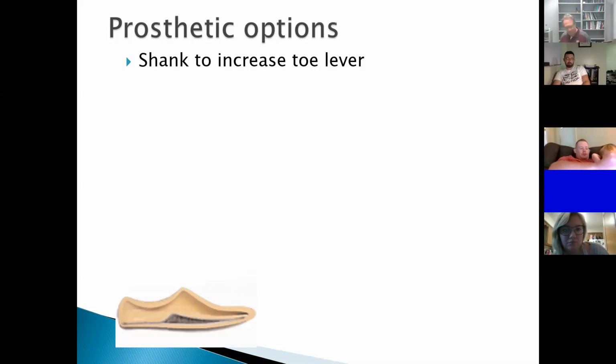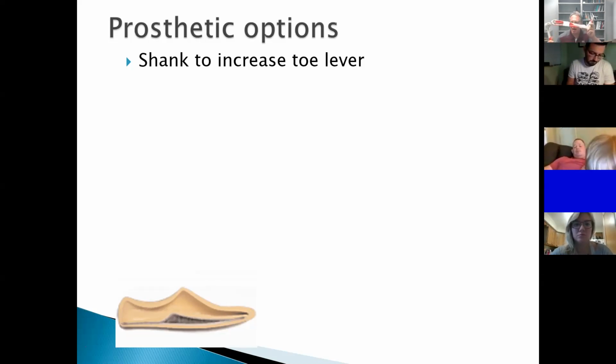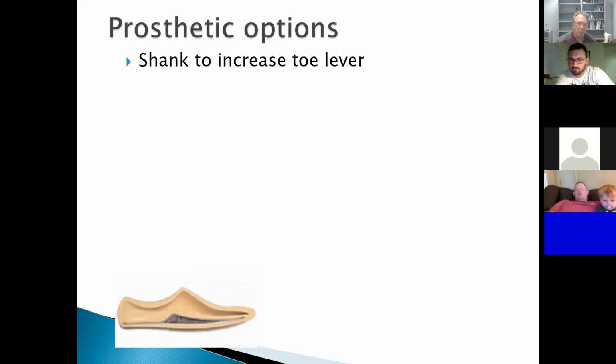One of them being the segment from the knee to the ankle. So that's something that we think of. One of them meaning this part of a shoe, or in this case, a prosthesis, something that just provides stiffness through the midfoot. And the third meaning is a homemade knife that is used in prison. That's not what we're thinking of, but we're thinking of one of these.